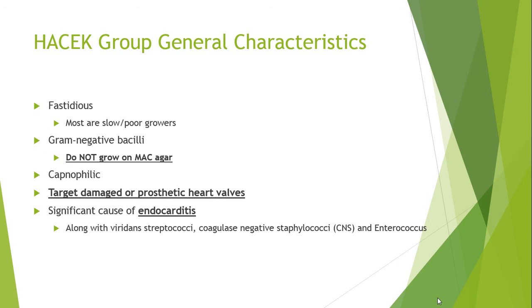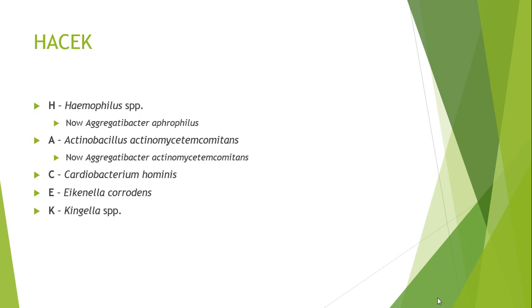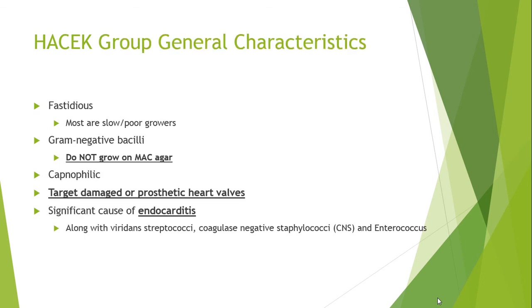All right. And we got our strep. If we've got to tell the difference between strep and staph and enterococcus, we could do a catalase, right? Strep is catalase negative, very good. And staph is catalase positive, very good. HACEK. I'll make sure you are able to tell the difference between viridans streptococcus and enterococcus. What tests do you do? Enterococcus is sodium chloride positive and PYR positive, whereas viridans streptococcus is negative.